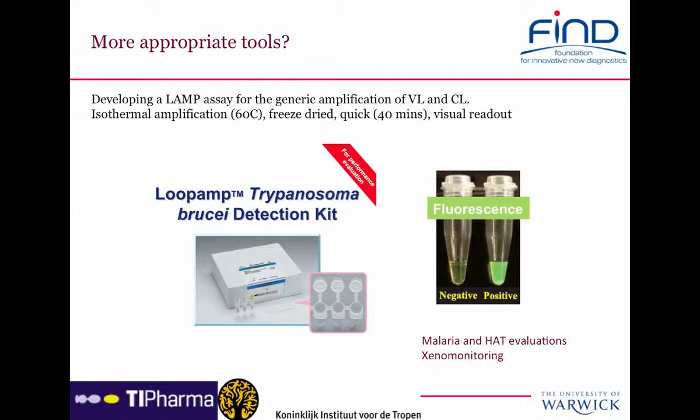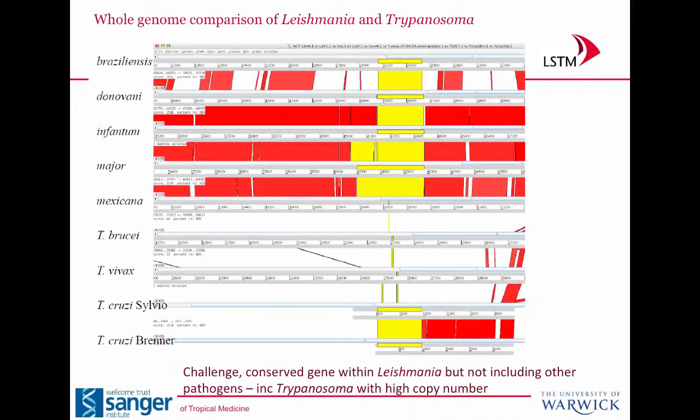What is now really important for us is to look at sample processing. If we require a full DNA extraction, there's no point having a simplified amplification, because then you need a well-equipped laboratory. So we're looking at simplified sample processing.